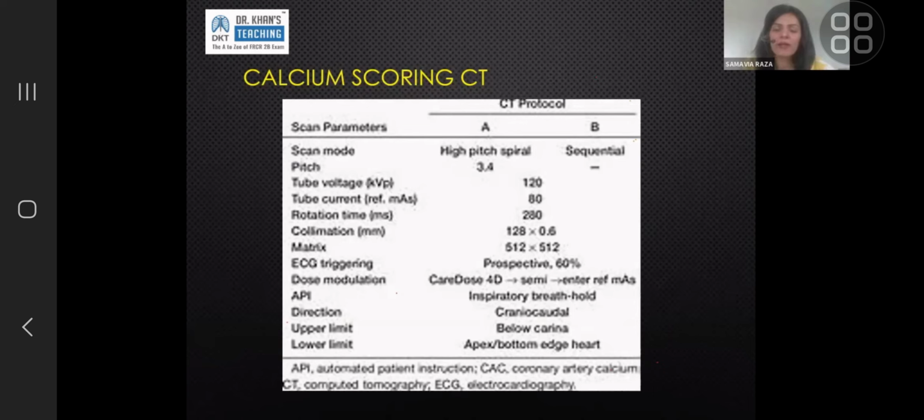It takes longer, but there is no point in doing that, because that number is invalid, because the values that we use for risk profile or the calcium score of 36 are based on an internationally validated tool that is only applicable if this calcium scoring CT was done on these specific parameters. So the parameters are collimation and rotation time and the voltage and the ECG triggering.